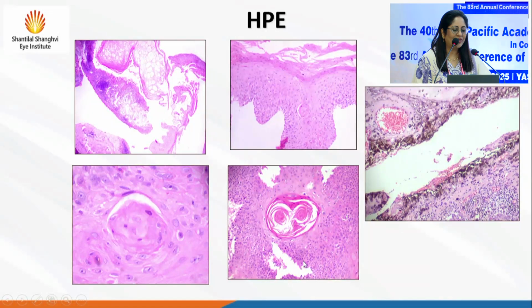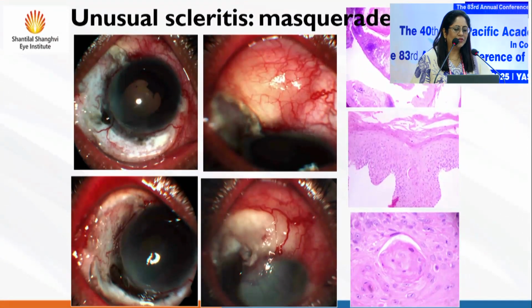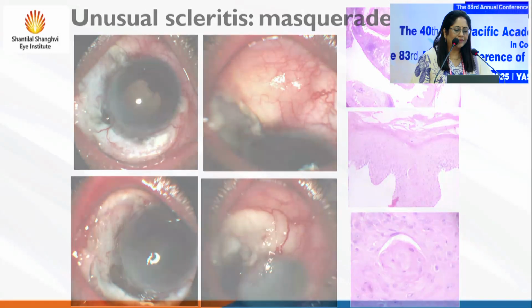You can see such proliferation of the tissues. So if these are the coats of the sclera, the OSSN was invading deep into the eye, as well as these typical squamous pearls that you see, and a lot of inflammation even along the uvea. So in the earlier part of the disease, the patient did have a lot of inflammation, which put us off track. But the keratic plaques, as the patient kept on following up, were the final clue. So this was too late to resuscitate the patient. This is in a nutshell what we saw for the patient.